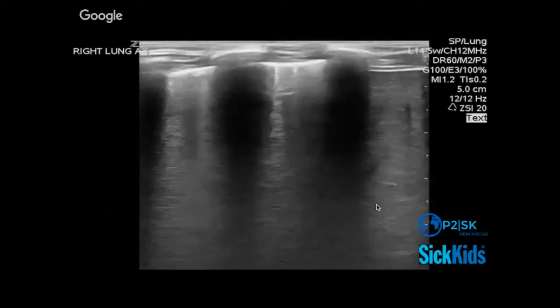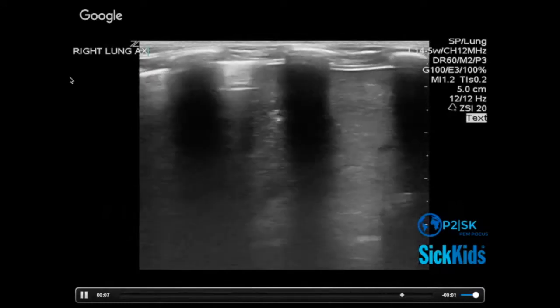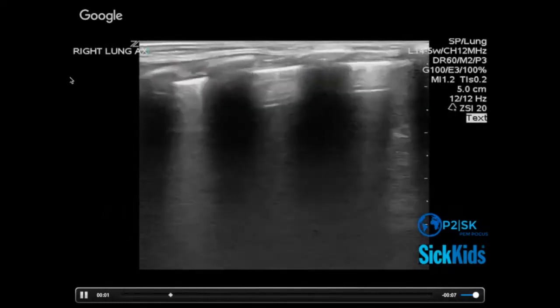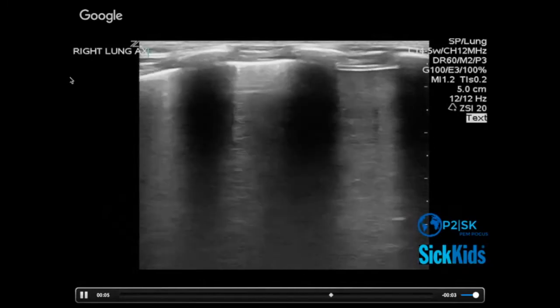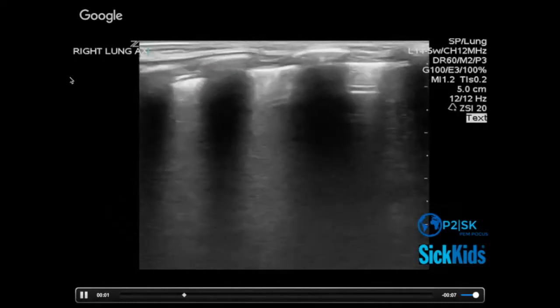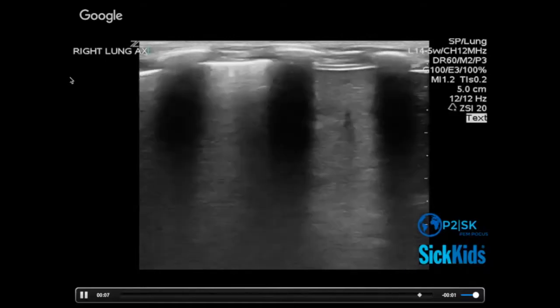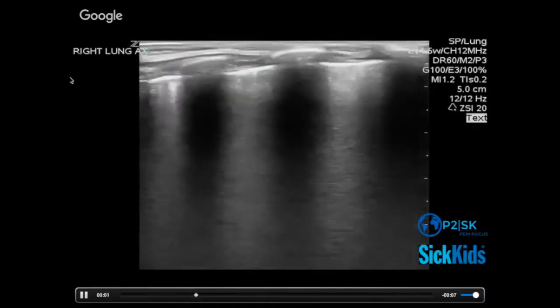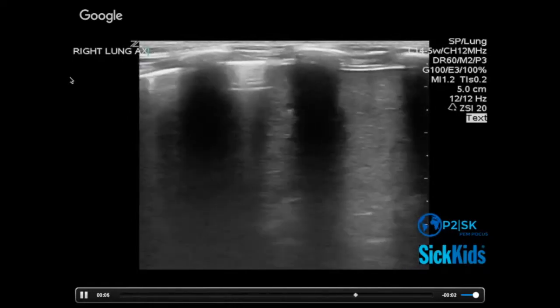And then, as it says up here, right lung axillary. What are the findings in these lung shots? Lots of B lines, right? The sonographic equivalent to crackles. Does this change your thinking in any way from my problem is left ventricular failure? Matches perfectly, right? So nothing to divert you. This febrile kid with shock would seem to have.